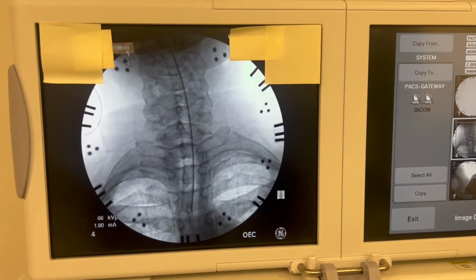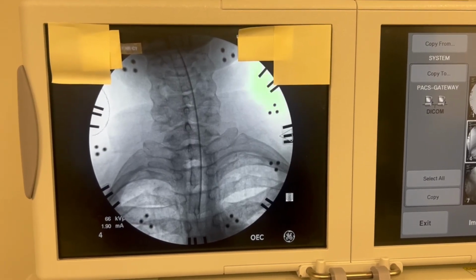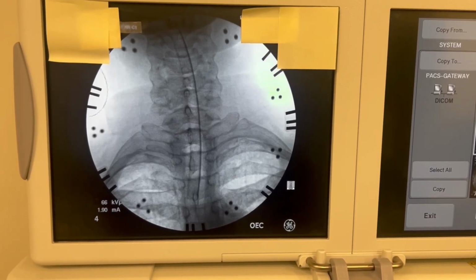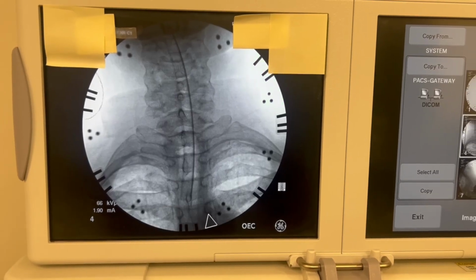You can use the smiley face on the image intensifier side that indicates the side towards the head of the patient. You should be able to use this as a reference point to know how you should orientate your image to either be flipped, rotated, or both.